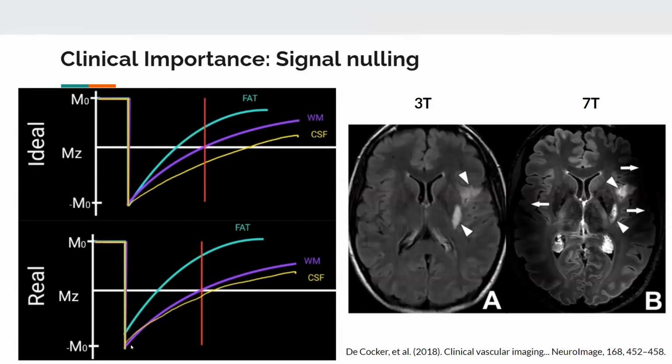So here's an example of the same patient being imaged using one of these inversion recovery pulses. They were scanned using both the 3T and 7T scanners. The 3T scan looks pretty good. There's not too many big artifacts that you can pinpoint. But for the 7T, there's a little bit of signal loss at the ends here. This arrow is pointing to some of the signal loss at the edges. And this occurred because of this B1 inhomogeneity, where not all the flips at the sides were able to flip the full 180. So we end up nulling some parts of this.